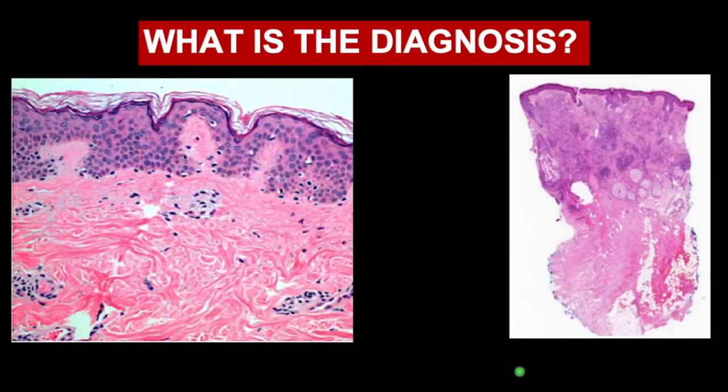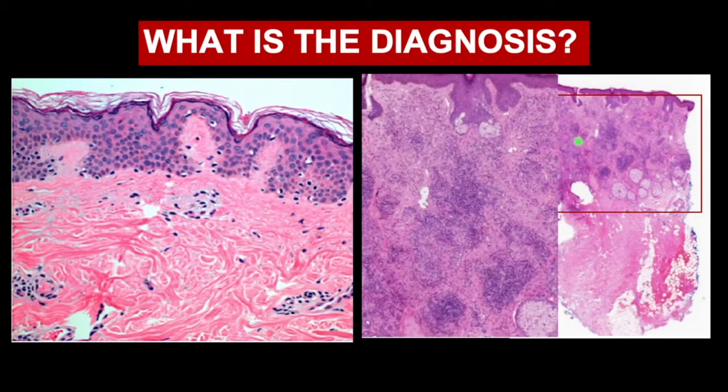So moving on, we are still in the category of the acute vasculitis, and you can pause the video now and try to identify this lesion. So we see here also in the dermal area, we have a busy dermis filled with neutrophils or maybe lymphocytes. We don't know, we have inflammatory cells. If we go on high power, we identify a collection of inflammatory cells. Most likely they are lymphocytes, and they are forming like a granuloma.